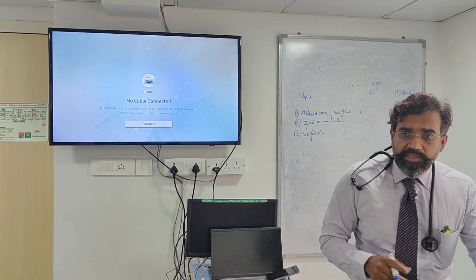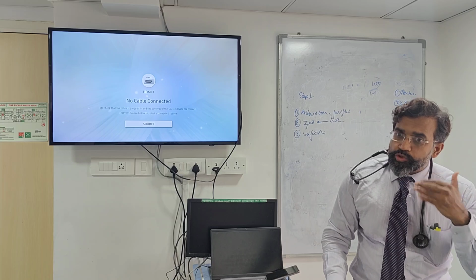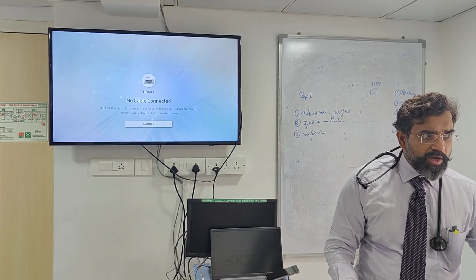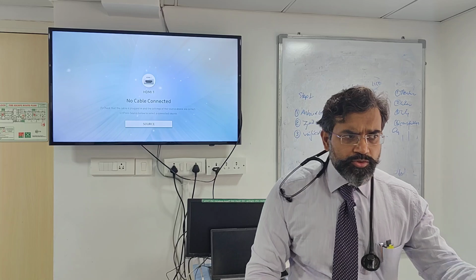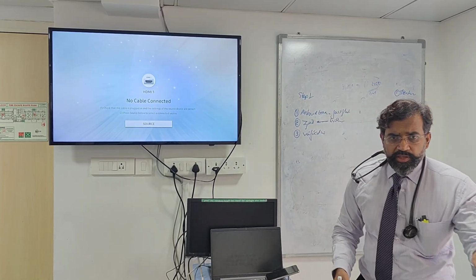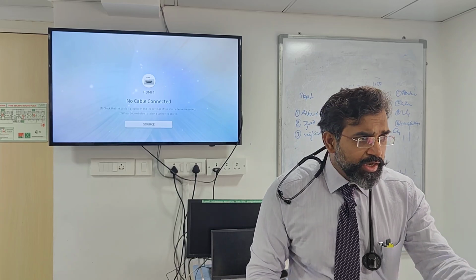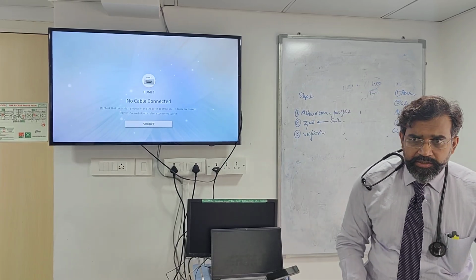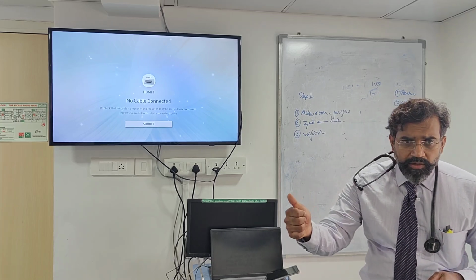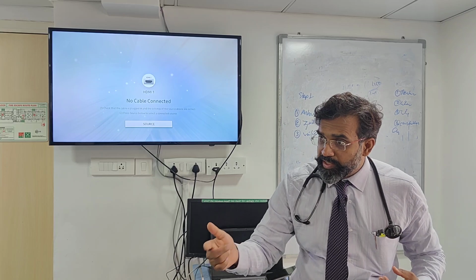If there is a three-way attached to this particular port, there cannot be a second three-way. There cannot be an infusion running through that port. This is completely dedicated to thermodilution. Clear on this? There cannot be a stopcock on that, or one of those needleless connections. So verify the position: the distal-most lumen of the line with no three-ways attached.